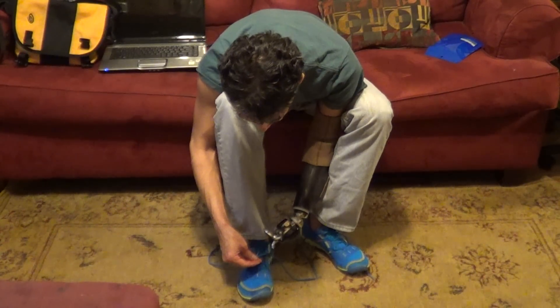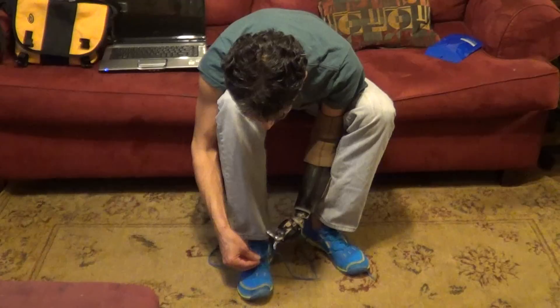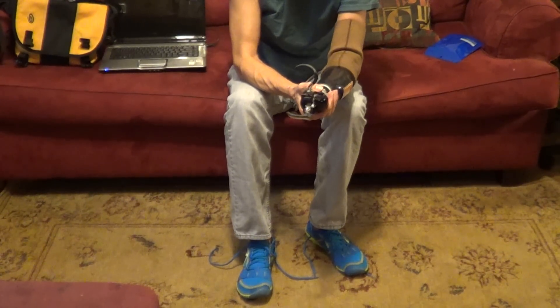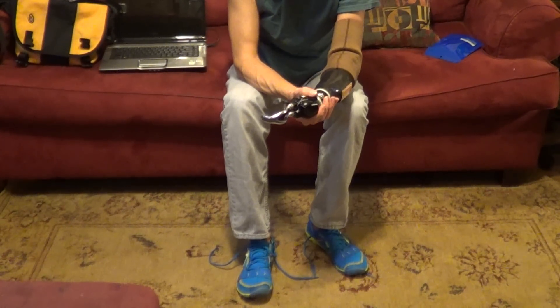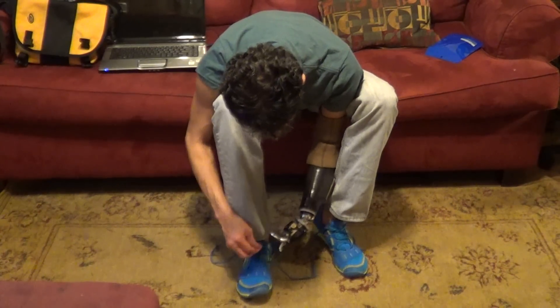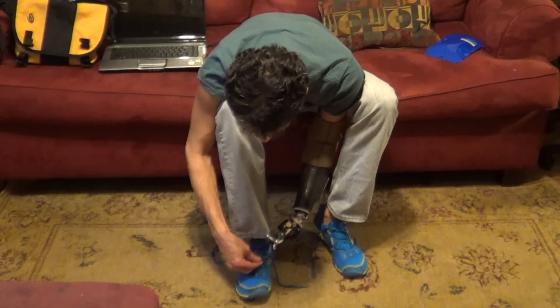Close. Come on. Close, close, close, close. Stop the flexion. Open, close, open, close. I'm thinking maybe I need to have it adjusted or something, because I'm seated all the way down in the prosthesis and I'm touching the sensor with my muscle as hard as I can.